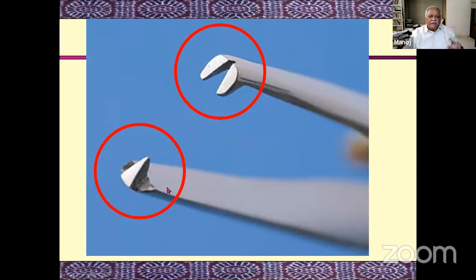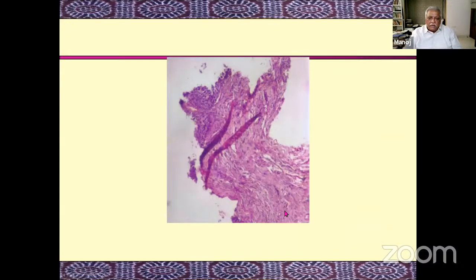The tooth forceps itself is a very dangerous thing because it makes the process of taking the biopsy simpler, but at times it causes the most unbelievable artifacts possible. I have a separate talk on artifacts, and in fact, a separate talk on these crush artifacts. This is what can occur because of injudicious use of a tooth forceps.